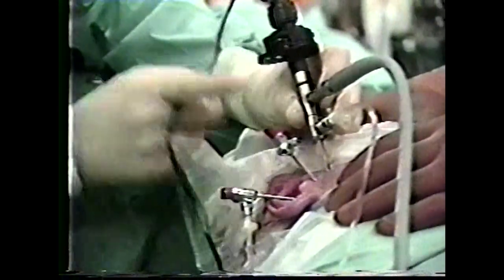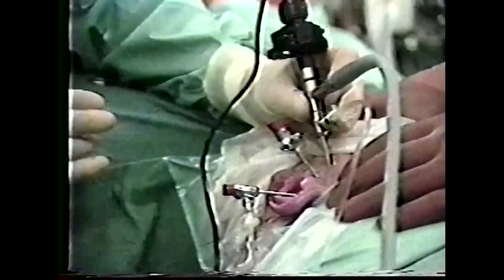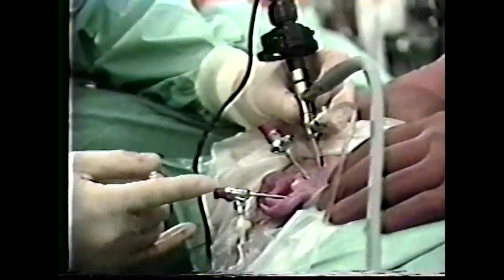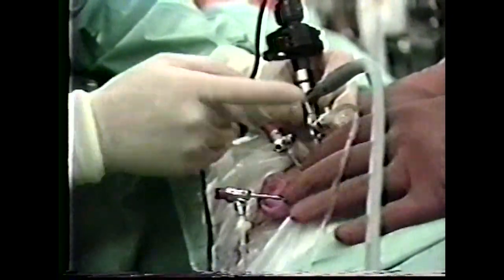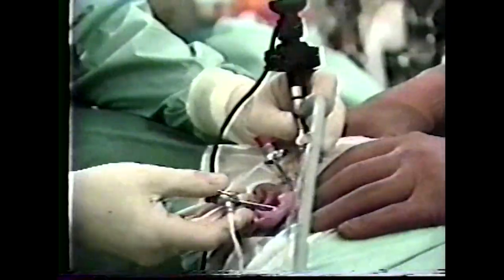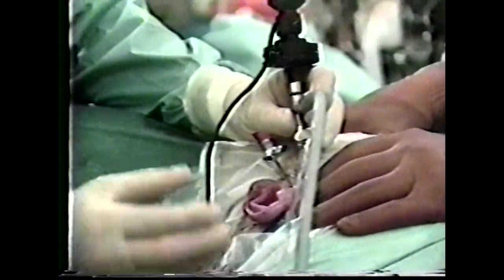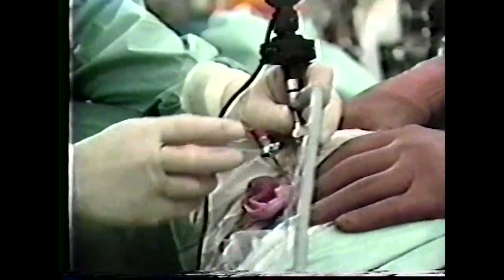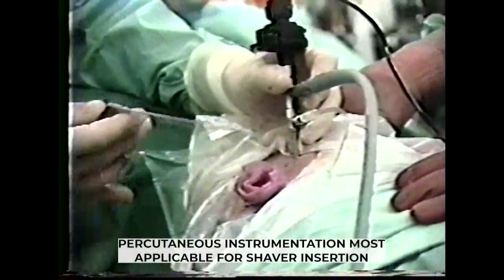Utilization of the endaural approach extends our surgical options. With cannulas placed endaurally, infralaterally, and anterolaterally, virtually all areas of the TM joint can be visualized and reached with instruments. And with care and sufficient dilation of the operating portals, instrumentation may be inserted directly into the joint percutaneously.